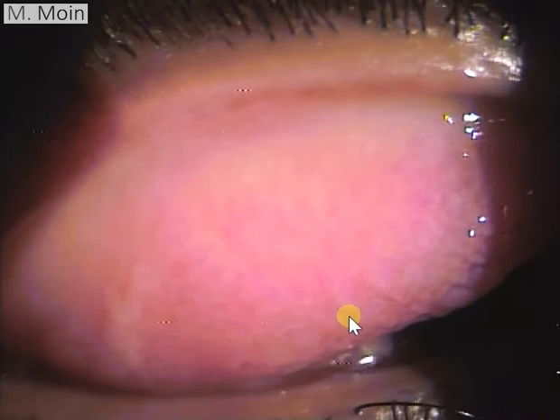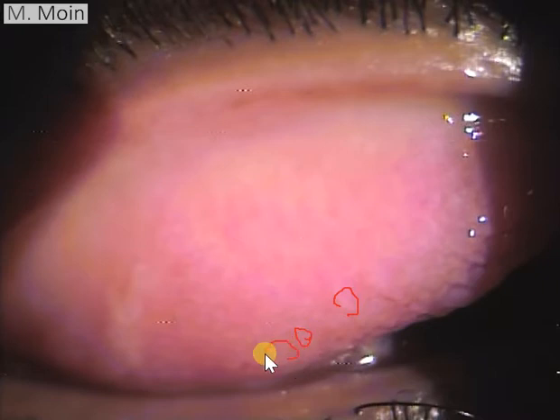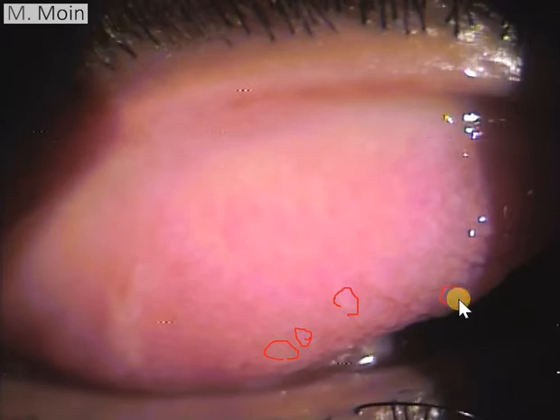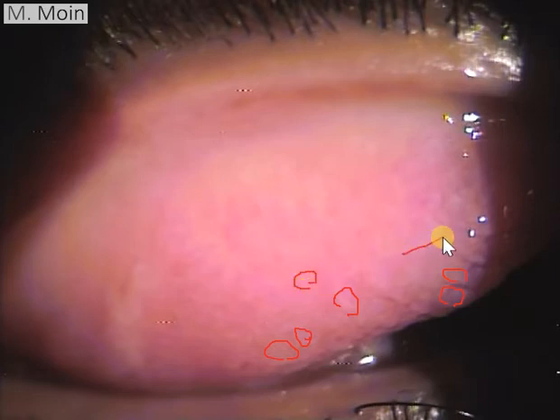The next important step is to evert the lid and look at it first at lower magnification and then at higher magnification. What I want to highlight here is the cobblestone appearance. If we grade this disease, these cobblestones are sort of mild to moderate in size, but obviously when you get giant papillae formation they will be much bigger.